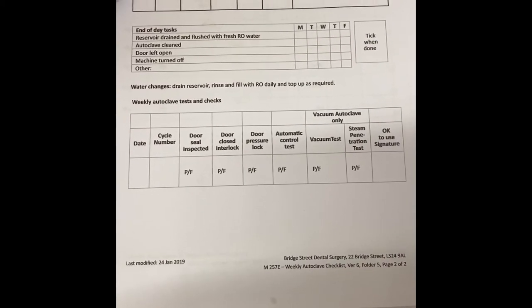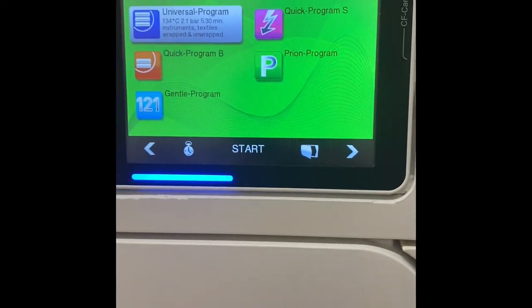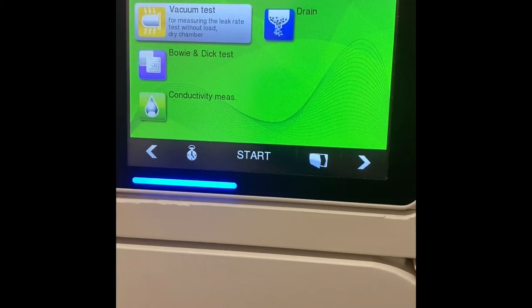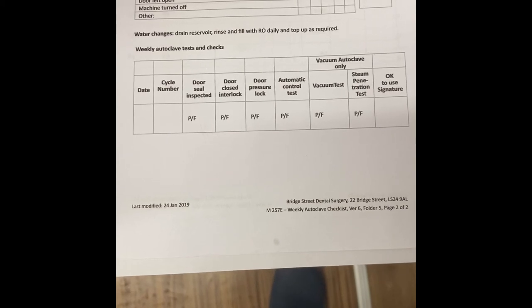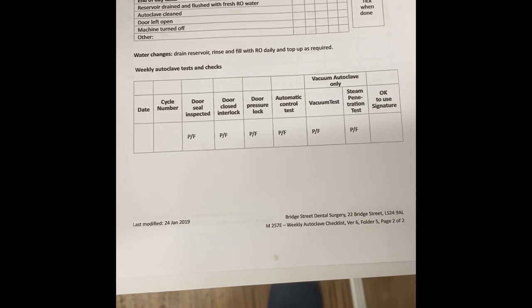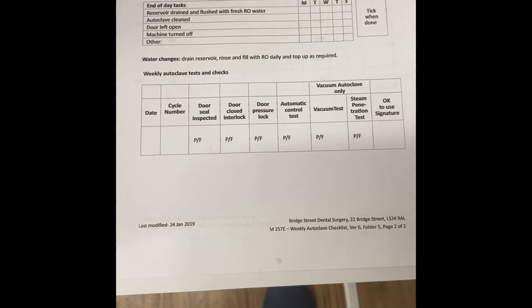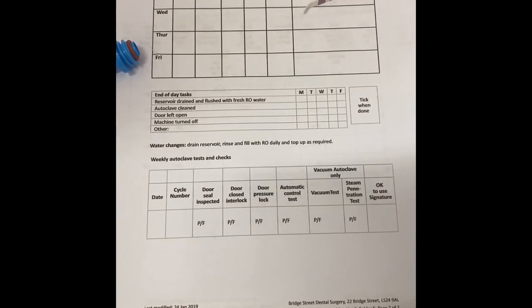On the bottom sheet, there are a few little bits to tick off. One of them is a vacuum test — this is not a sterilisation cycle, so no instruments must be in there. We go to the next screen, click vacuum test, and press the start button. This will complete the cycle and give a success or failure. Once done, complete the little form at the bottom: we need a date, confirm the door seal has been inspected, the closed door interlock and pressure lock, the automatic control test — which is controlled by the data logger and will be read later — the vacuum test pass or fail, and the steam penetration tests based on the TFT strips above.